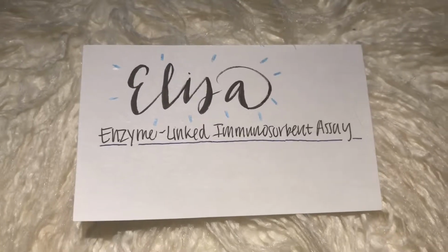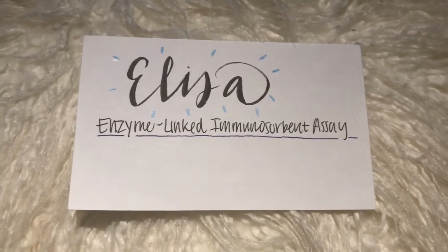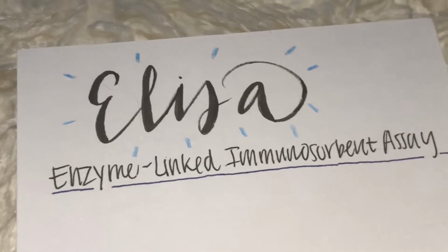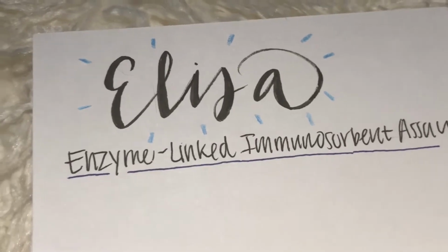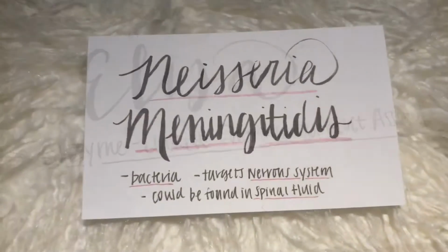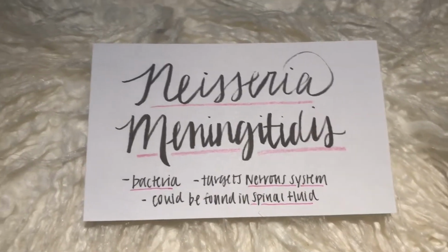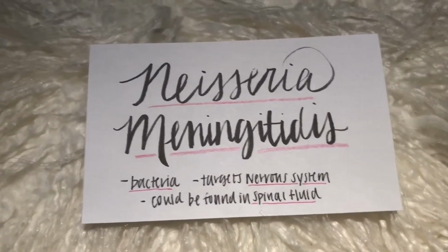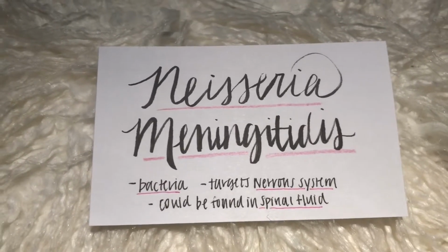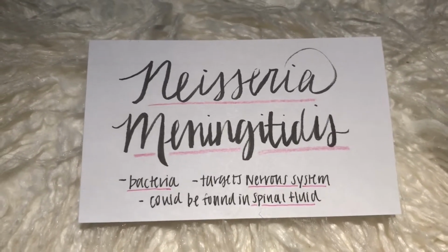Hey guys, today we're talking about ELISA, which is also known as enzyme-linked immunosorbent assay. There are many uses for ELISA, and basically this just informs you about whether there are any specific foreign antigens within your body. In our case, we're tracking down Neisseria meningitidis, a bacteria that targets the nervous system, and this bacteria can be found within your spinal fluid.